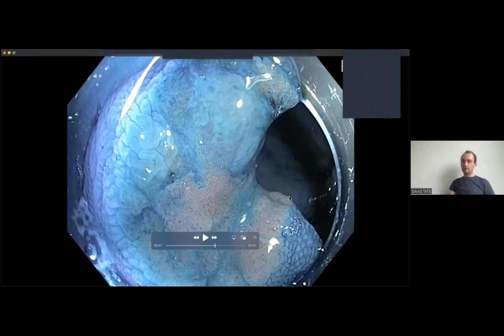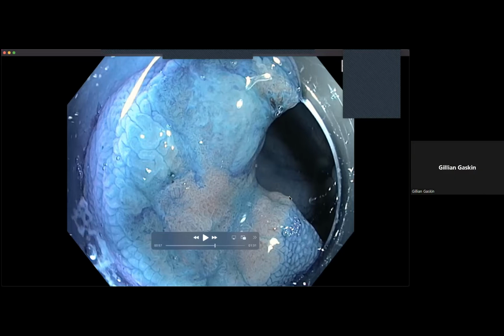But there is one part of it where that's true, and there is one part of it where that's not true. So maybe if you could point, which I know you can't, just tell me top or bottom of the demarcated area, which you think has completely lost its structure. Probably the bottom part. Yeah, that's interesting, isn't it?